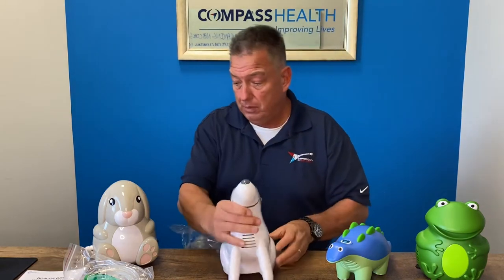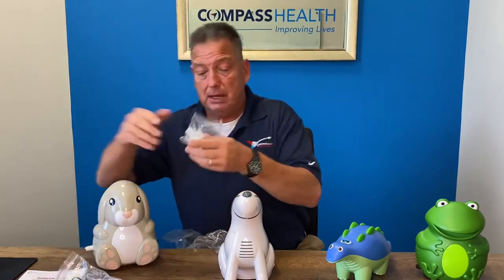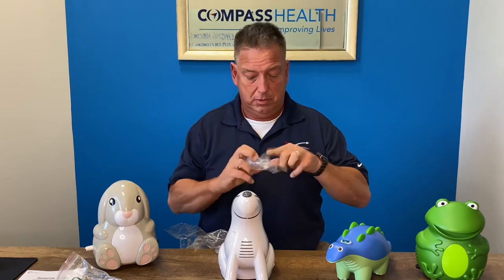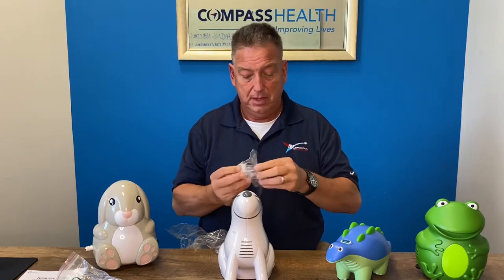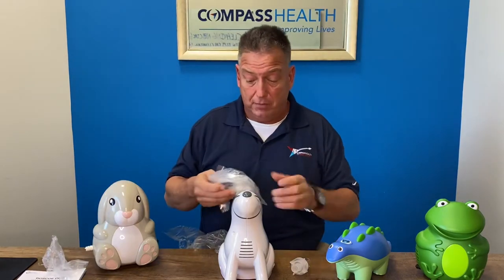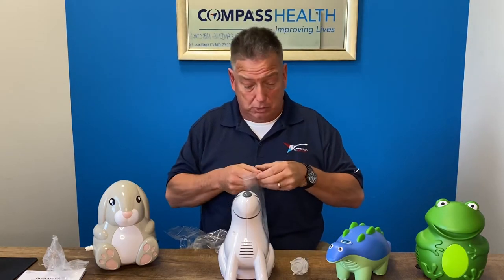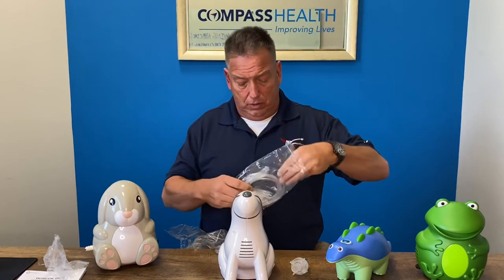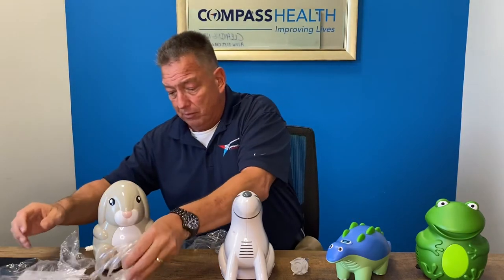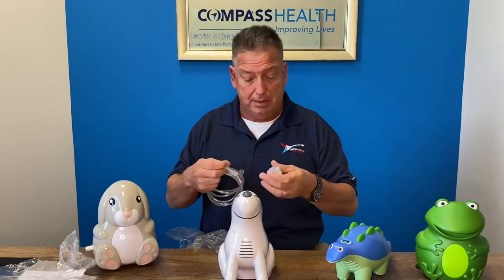So we're just going to assemble the medicine cup here. This is a disposable medicine cup. These units are available with reusable medicine cups as well, as well as faster treatment times.